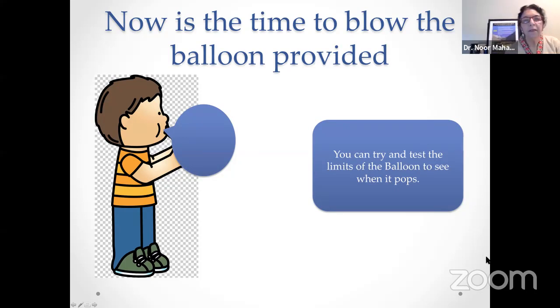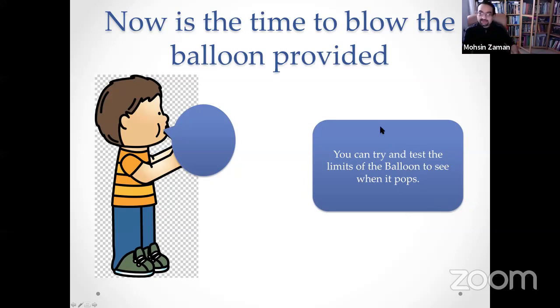Listen, there is a question. Shall we use high flow nasal cannula without CPAP or BiPAP? So the high flow cannula, as I said, evidence is lacking. Usually it depends on individual practices, but we do know that it does become more comfortable. The patients find it easier to tolerate a nasal high flow cannula as opposed to CPAP.